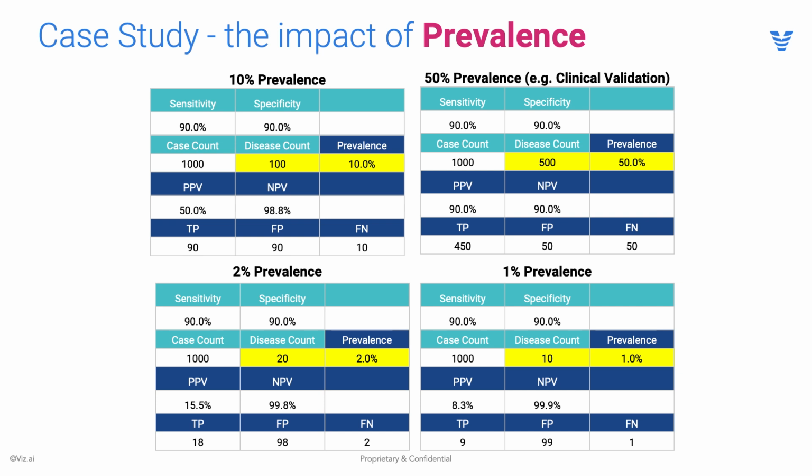So again, if you go back to that last time a customer asked you, what's the PPV of an algorithm? These are things we have to take into consideration. What is the prevalence? Is the prevalence at this hospital similar to what we see at other hospitals? Is this disease consistently the same prevalence? Is the clinical study that they were emailed showing one thing, but they're seeing another? Why might this be? And how could I help explain this to them? And how can I mitigate this from actually becoming a challenge once they turn the software on?